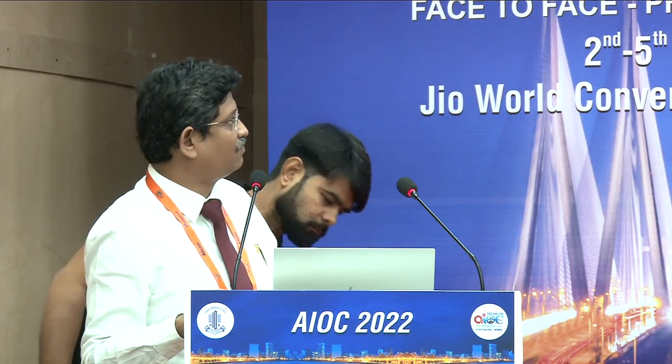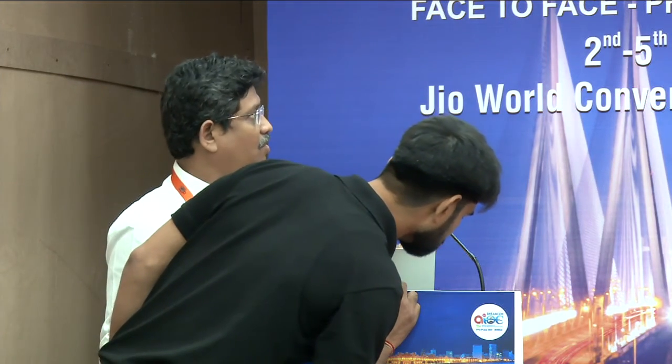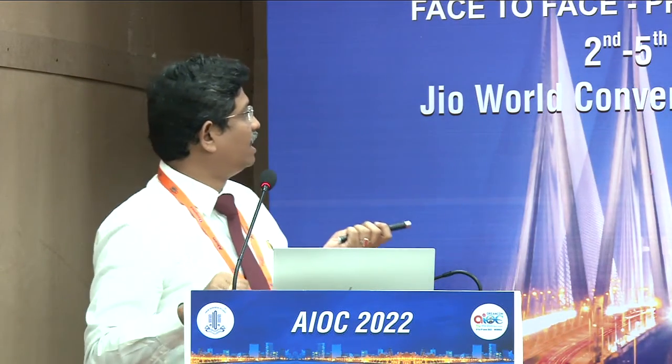When you have a larger size of hole, you always plan preoperatively for this inverse flap technique or envelope technique. But when you have peeled enough and have done that, you don't have any other option other than doing a free flap and putting it in there. Now the question comes: if you put only this free flap into that non-closed hole, what is the utility of putting that flap there? It causes fibrosis only on that area, and SD-OCT shows that only a scar remains.